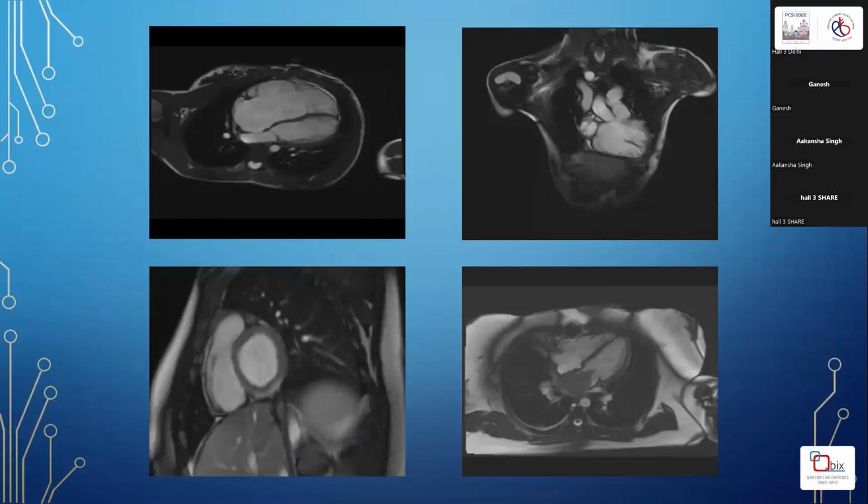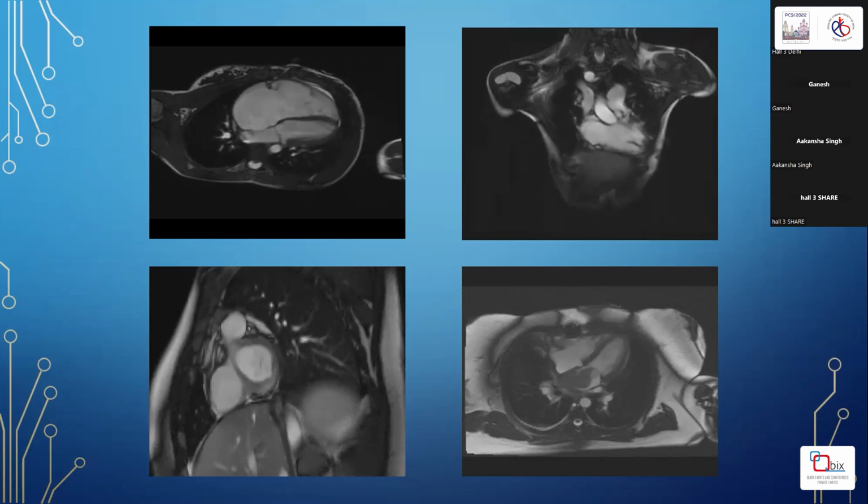Whenever we think of pediatric cardiac MRI, what jumps to mind is usually the RV volumes for Ebstein, pulmonary regurgitation fraction post-ICR, your run-of-the-mill patient with myocarditis, or even the odd striking cardiac tumor.